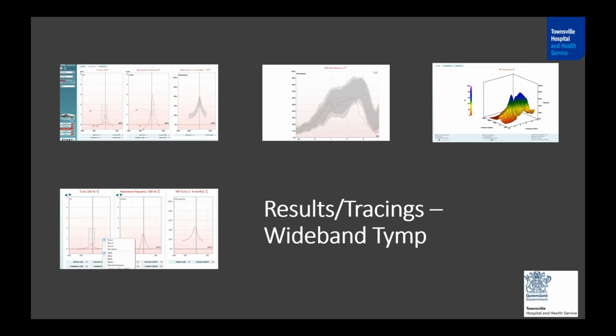Okay. But it also talked of different races, and there are studies of different races. The norms are slightly different. Is it clinically significant? The ethnicity, did you say, Vanaja? Yeah. No, we found it was not clinically significant. Okay. But as I said, there's one study on otosclerosis, and when they compared Chinese versus Caucasians, they did find that when they used the ethnic specific norms, the test performance improved to identify otosclerosis. But that was one study. We don't have many studies, but as of now, it's clinically not that significant to use ethnic specific norms.